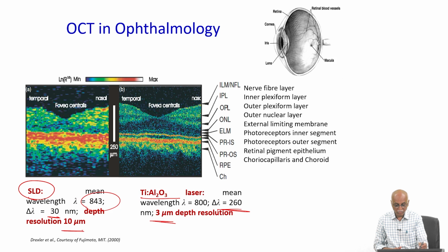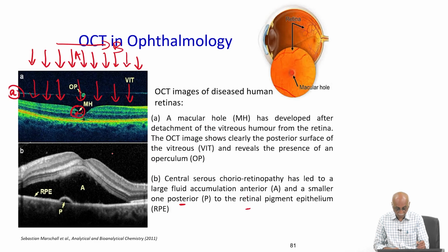Okay, and then try to see the penetration. So, layer by layer information, this is a colored image, where refractive index changes corresponding with the reflection peaks are converted into a color image, and not only that, A scan, the B scan allows the full depth wise information of each layer of the ophthalmology.